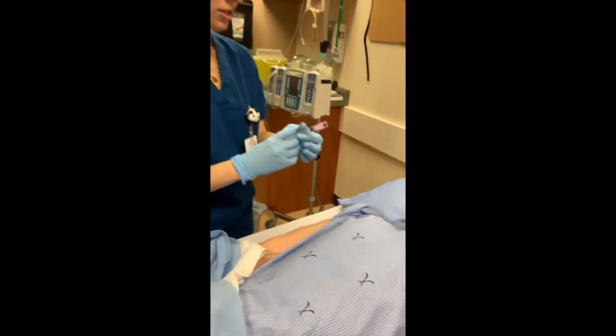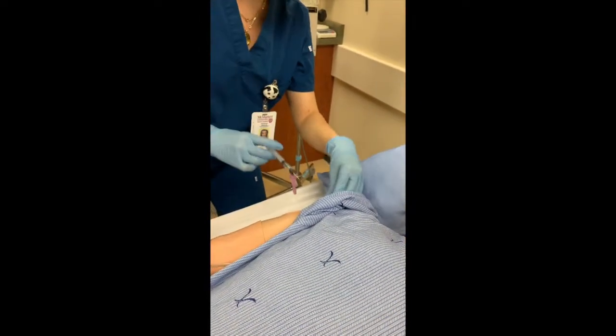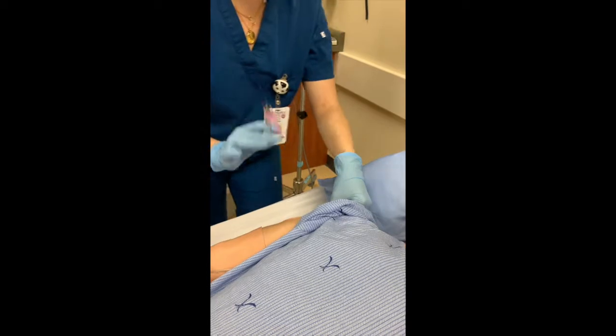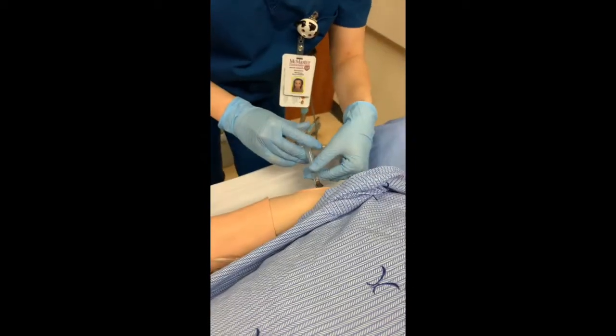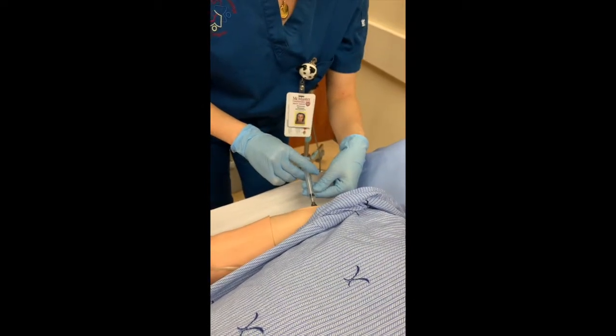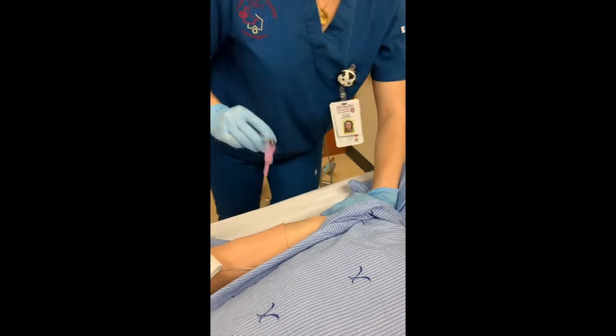Okay. You want to make this as fast but efficient as possible, just to reduce the pain in the patient. So I'm taking the needle. Okay, Mr. Mancini, I'm going to be giving your injection. I'm going to count to 3. 1, 2, 3. So I'm going to insert it, and then I'm just going to release the medication inside. Once that's done, hold the skin, pull it out.